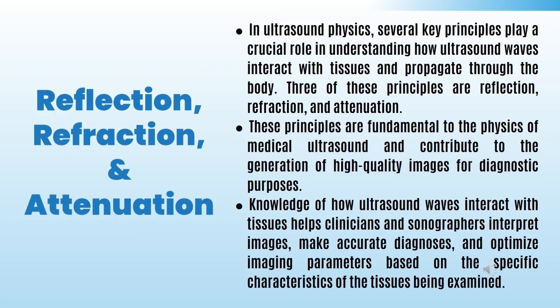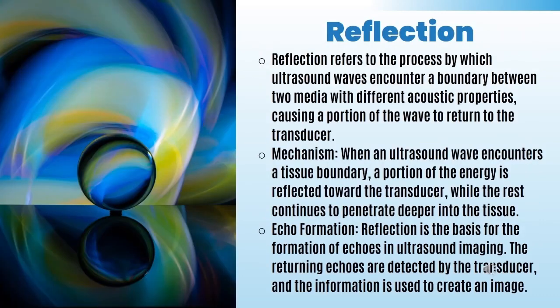So, in other words, these are three types of things that you can encounter when different types of tissue or organs or artifacts come into play in an ultrasound image. So reflection is something that sounds exactly like looking in the mirror. It's a reflection of a sound beam or a sound wave.